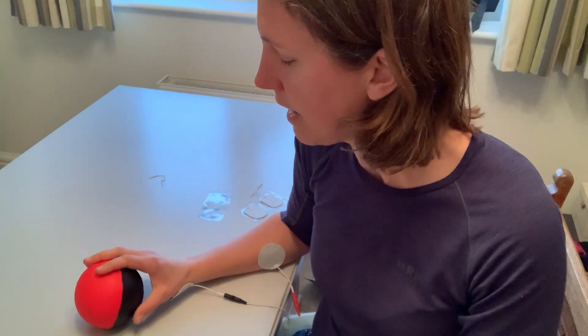Remembering to engage, look at the object, and work with the stimulator. Thank you.